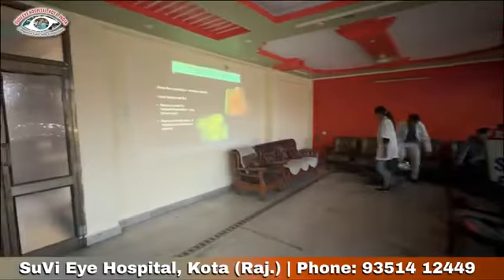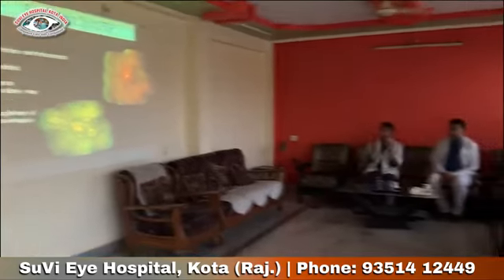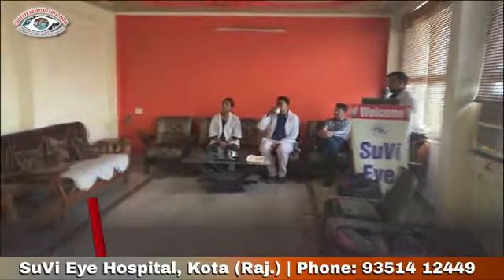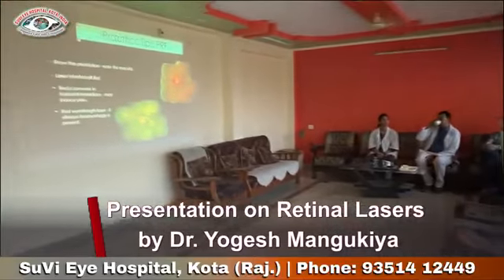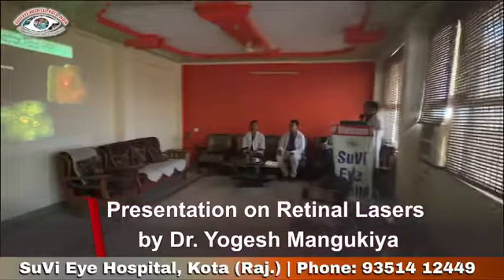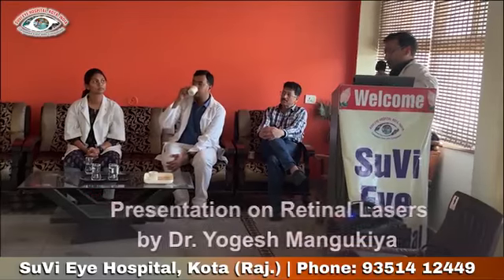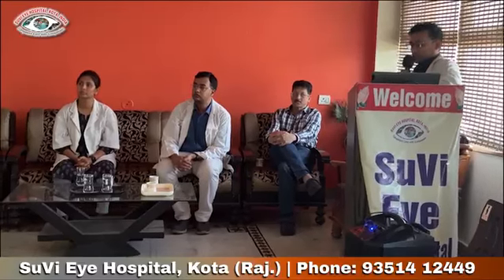Thank you. On the practical tips, first in laser we have to see the orientation. Do the inferior first, and reduce power in the horizontal meridian, because when you put the laser in the horizontal meridian, we have to reduce the power at that level. If there is a vitreous hemorrhage, we have to increase the power, or if it is not possible and a red laser is available, then we have to switch to the red laser.